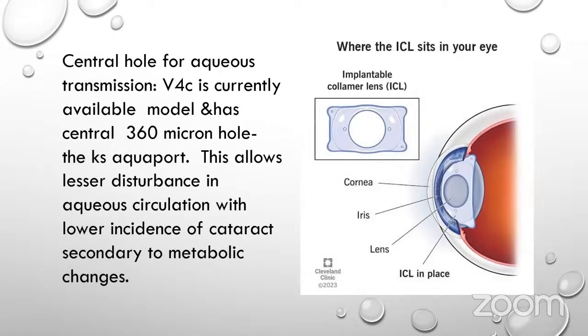Central hole for aqueous transmission. The V4C is the currently available model and has a central 360 micron hole, the KS Aquaport. This allows a lesser disturbance in the aqueous circulation with a lower incidence of cataract secondary to metabolic changes.